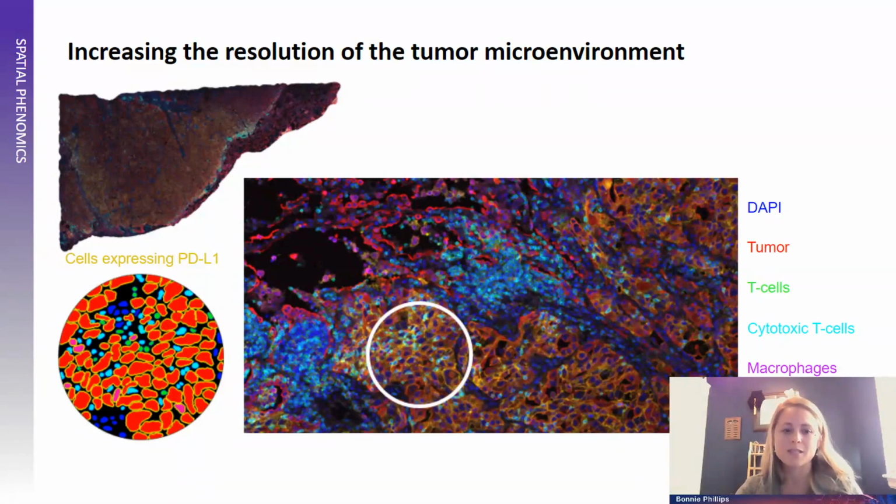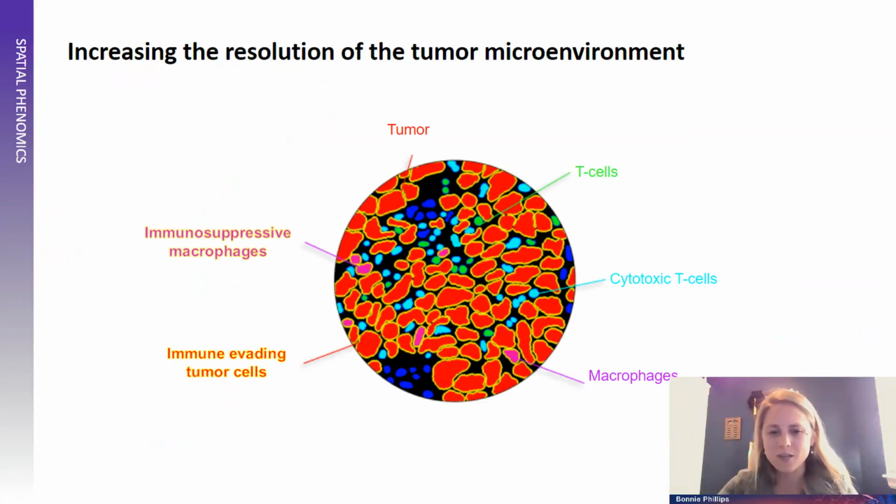And unfortunately, what we can see here is this particular individual has a very large amount of PD-L1 being expressed. So unfortunately, those cytotoxic T cells that have made their way into the tumor likely won't be performing their cytotoxic function on the tumor itself. However, it is possible that this patient might be a good candidate for anti-PD-L1 therapies based on the amount of PD-L1 being expressed. So hopefully that is good news for this particular individual.